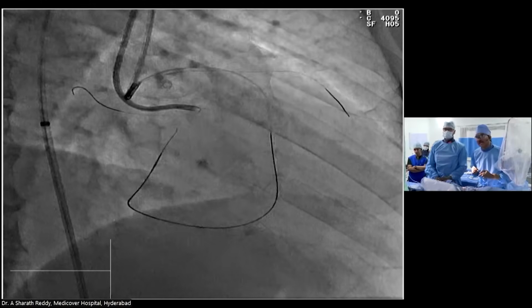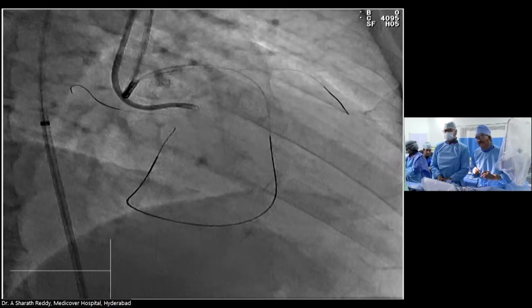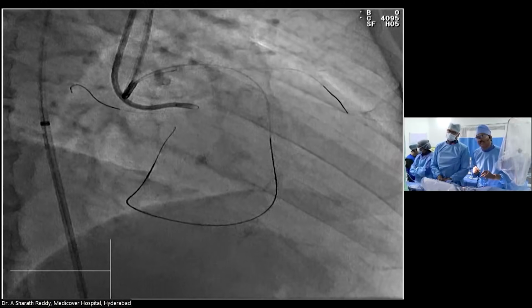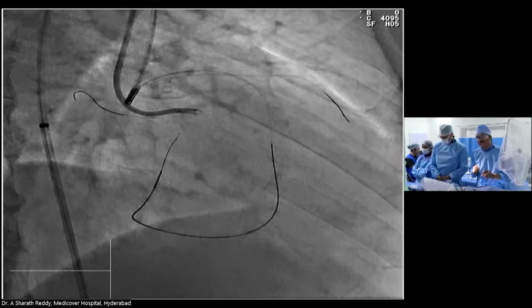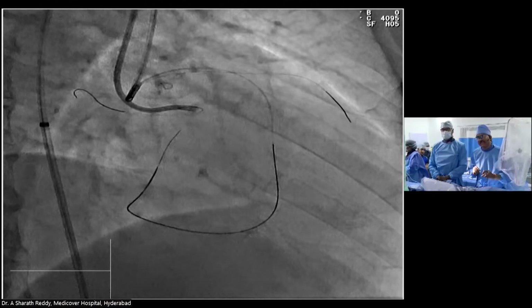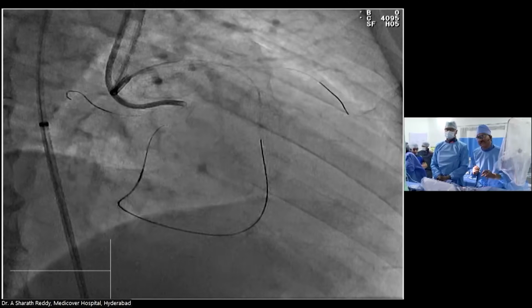I think you must have microcatheter back again. What are you doing? What is your plan to understand the angio? I'm only just trying to penetrate the cap and go a little bit into the CTO segment. Then I'll de-escalate the wire to Gaia 3. But I thought you had already penetrated. Yes.